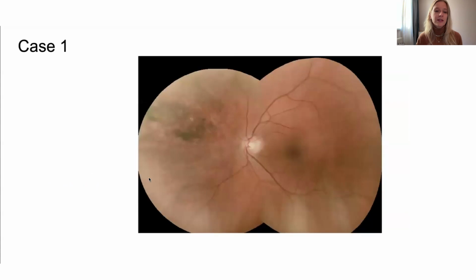And also we can see the other eye where a retinal scar is present in the nasal part, which presents as inactive CMV disease at that time. And also these images were taken by the infectionist with the camera already mentioned today, the Pristine retinal camera, and were sent to the ophthalmologist to make an evaluation.